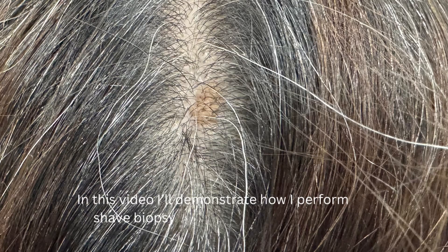In this video, I'll demonstrate how I perform shave biopsy and removal of a clinical sebaceous nevus.